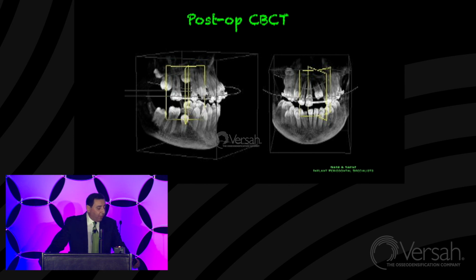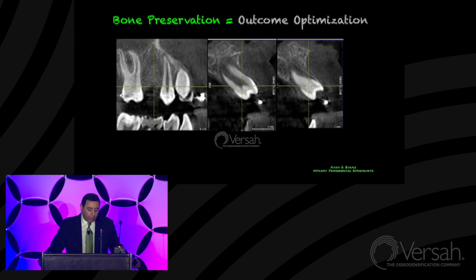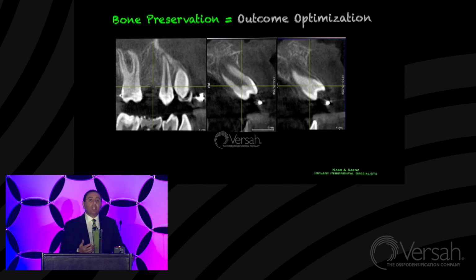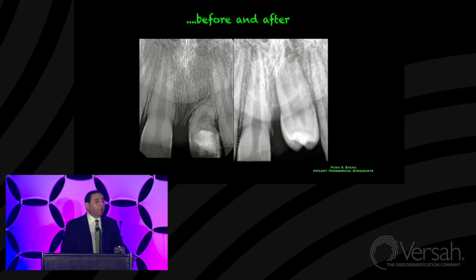So in this particular case, we've done bone preservation to optimize the outcome. So it's an outcome optimization on a clinical case that I thought would be a nice application. I haven't seen it with the Versah drill system before, so I thought this would be a nice case to show you and see that the bone has been preserved on the facial aspect of that tooth in both cross sections, and now orthodontic treatments will begin. This is the before and after of Caleb. This is the supernumerary tooth, and now this is the premolar, which will be guided so that once everything is in place, his restorative dentist will shape it to look like a central incisor, just like all the articles that were published from Norway over the last 40 years.